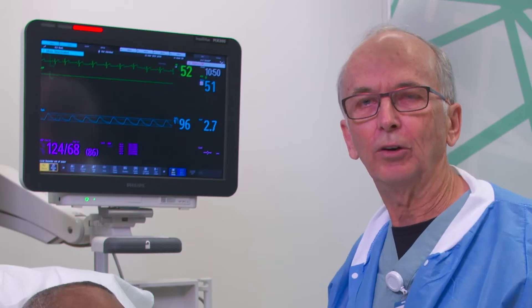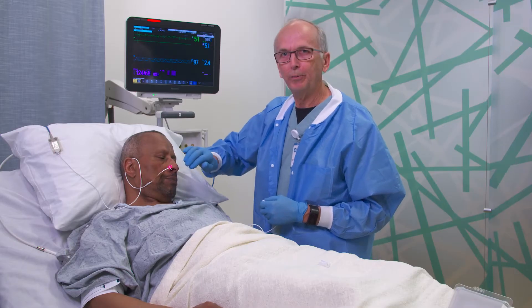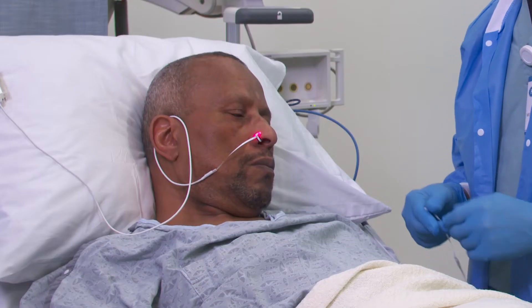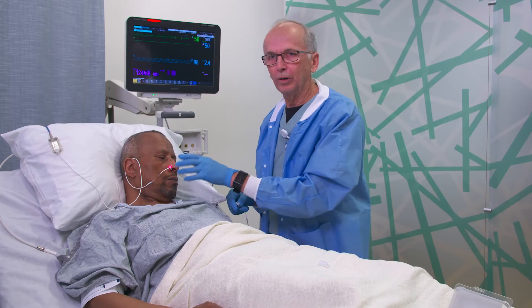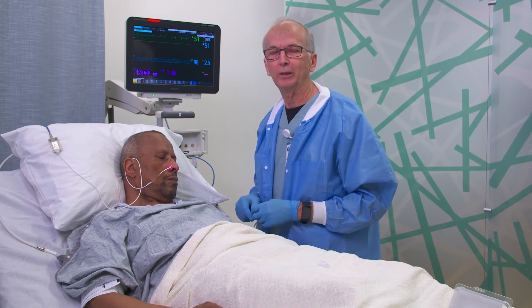Ideally, you are over 1, and I've seen this number as high as in the 20s. Generally, the number from the nose is much higher than it is from an extremity. That's an example of why it works so well here when it isn't working other places — because you simply have a bigger signal.